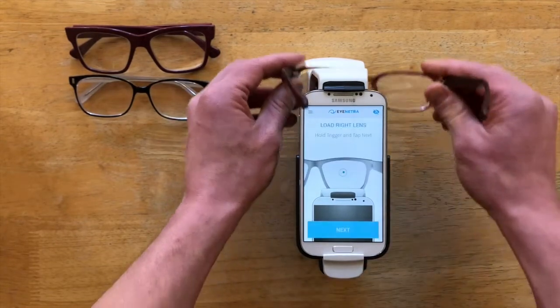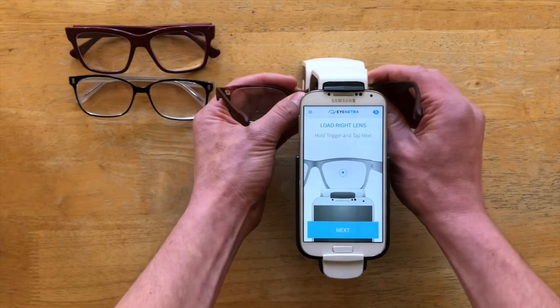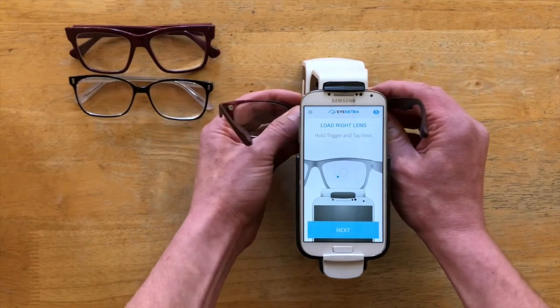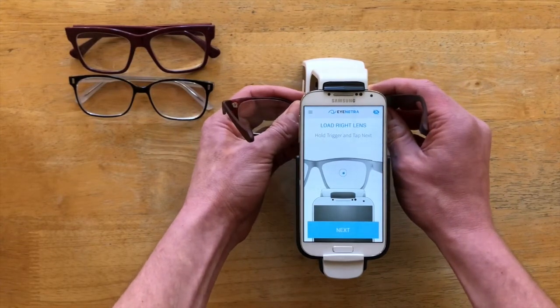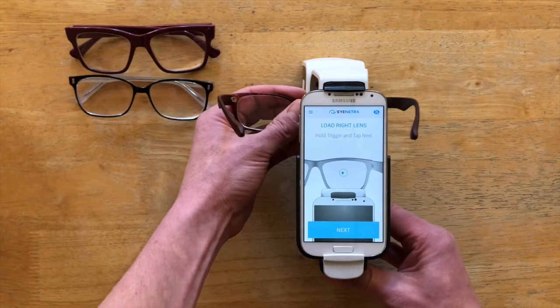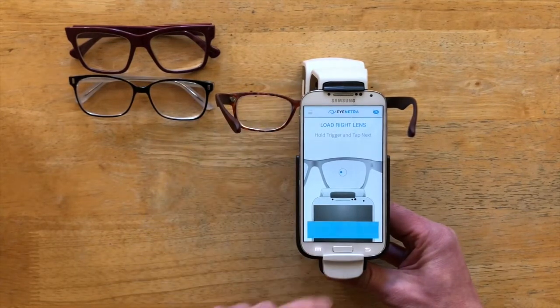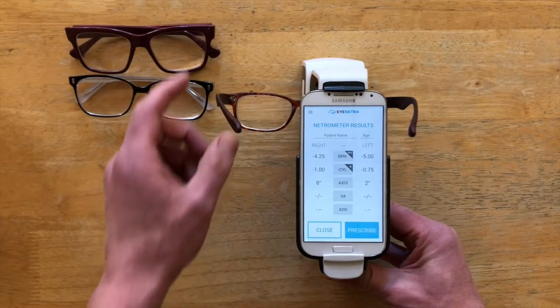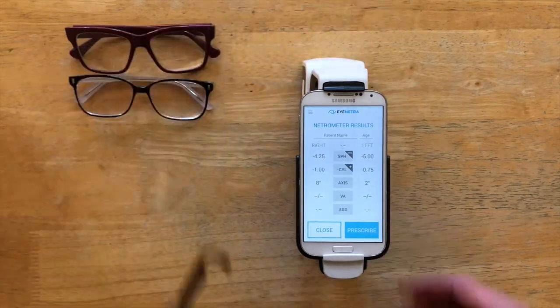And then just repeat on the other side. Right lens, insert, align the dot in the circle, squeeze the trigger to hold them in place, and tap next. And there are my results. That was easy.